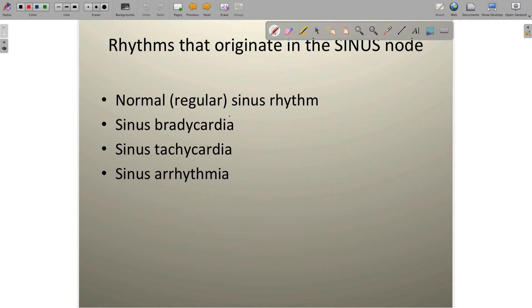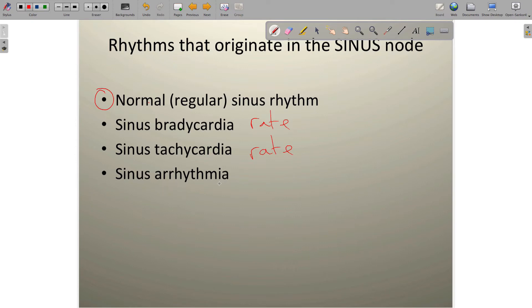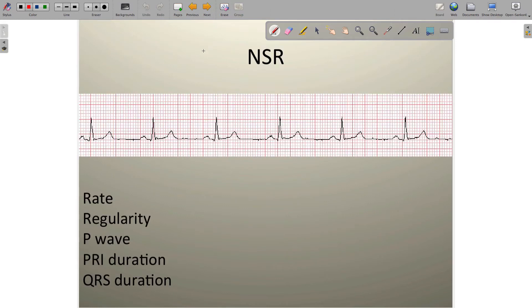Let's take a look at the four sinus rhythms we need to focus on: normal or regular sinus rhythm, sinus bradycardia, sinus tachycardia, and sinus arrhythmia. Once you get the rules for normal sinus rhythm down, you'll notice that the only difference between normal sinus rhythm and sinus brady is the rate, the only difference from sinus tachycardia is the rate, and the only difference with sinus arrhythmia is the rhythm or regularity. Just by changing one variable, we get a whole new underlying rhythm.